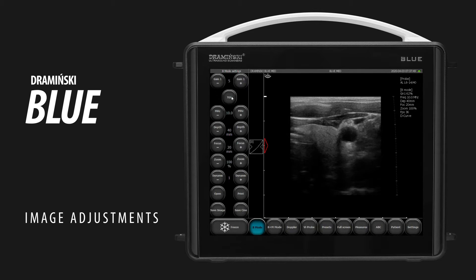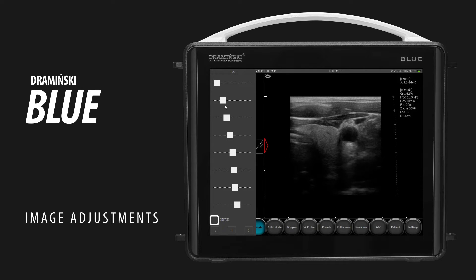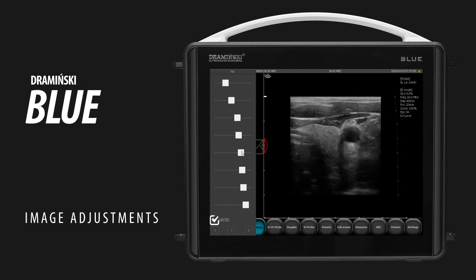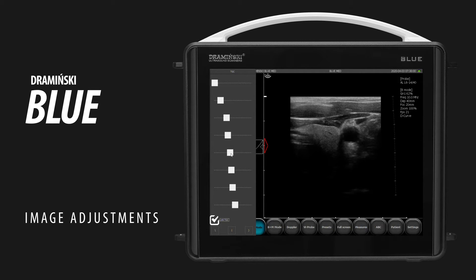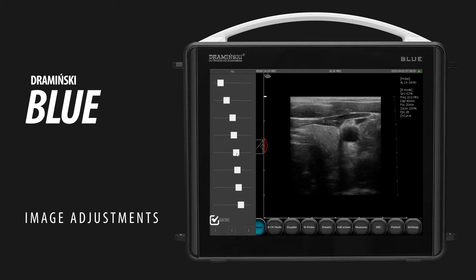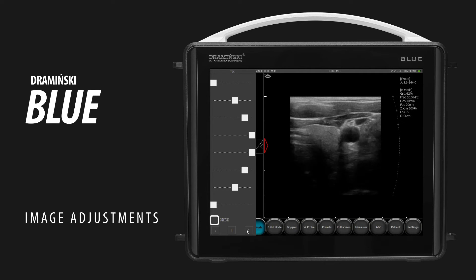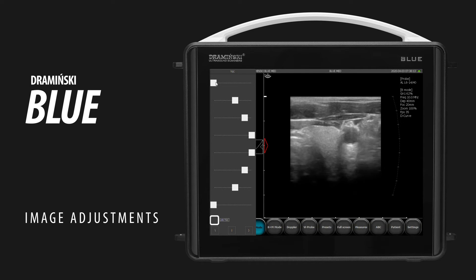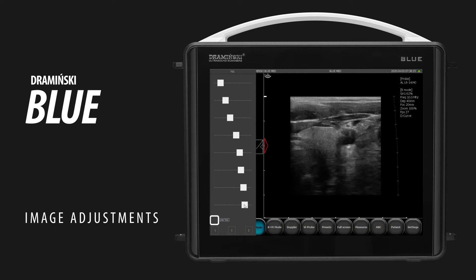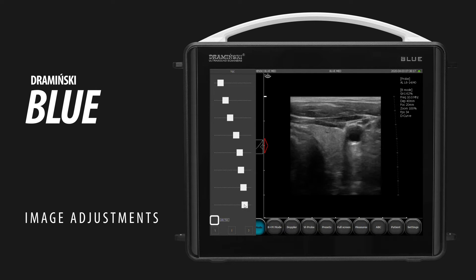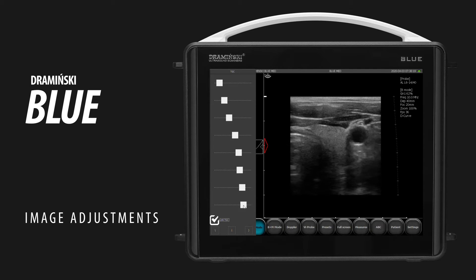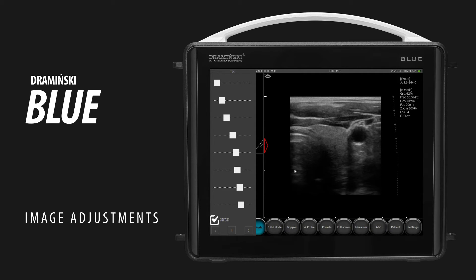To adjust time gain control, tap TGC. You may slide each knob separately or link and adjust all of them at the same time. For a quick arrangement, use one of the TGC presets or swipe with your finger from the top to the bottom of the window. Wait until the TGC window disappears automatically or tap on the image.